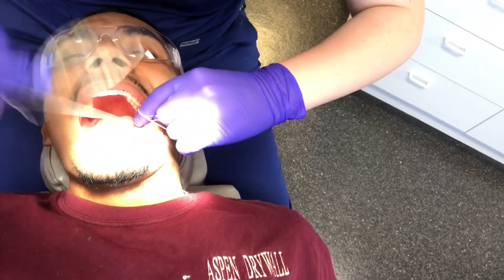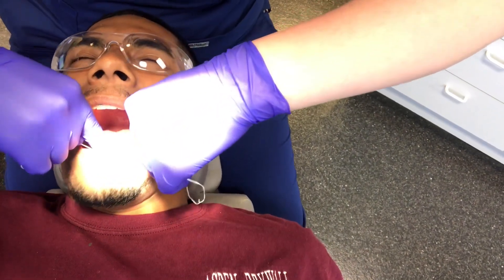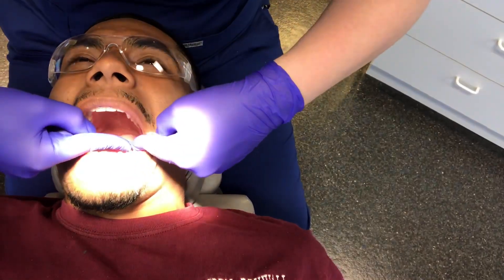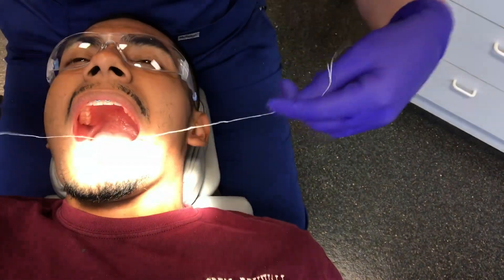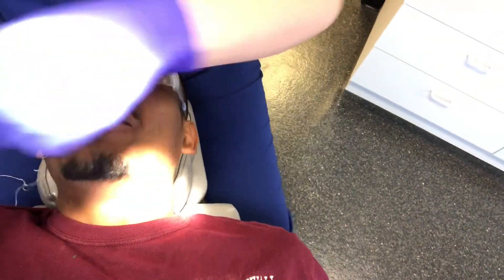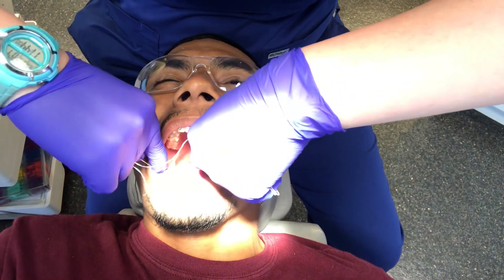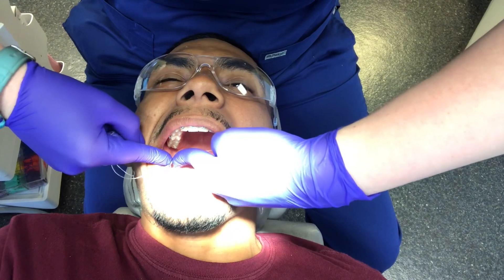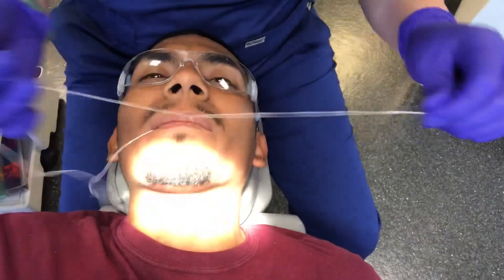I'm going to do the next one with the rubber one and floss. This one is not as tight, so I'm not too worried about it. You're going to feel that pressure. I'm going to wiggle it and we're going to relieve the pressure. This one is not as tight, so I'm not going to go as hard. And I'm done. Felt how it kind of snapped into place? And now when you bite down, it's going to feel like you're chewing on rubber a little bit. All right, two more. Here's that pressure. That's it. A little wiggle. One more on the bottom — the ones that have a little bit of space are a lot easier.